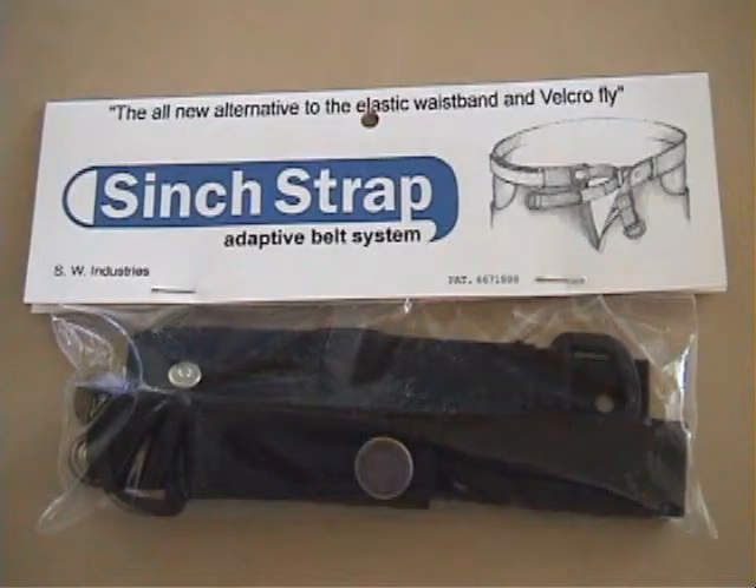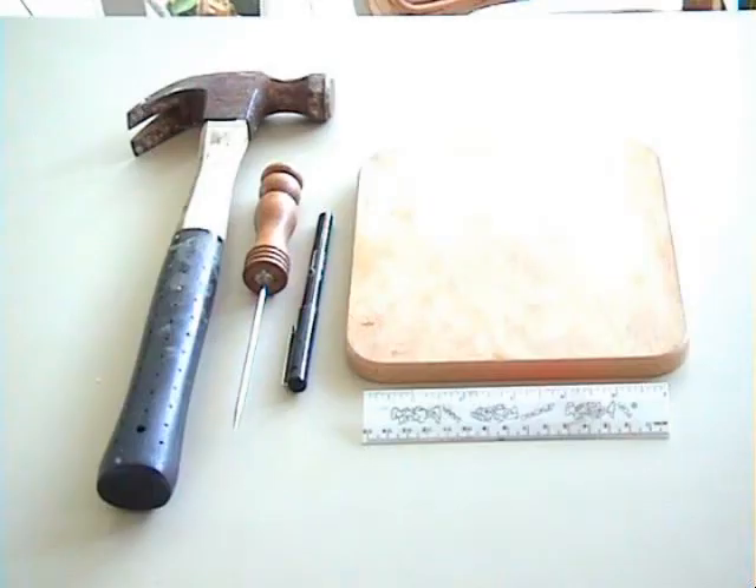The Cinchstrap belt system was designed and patented by an individual who has extreme hand limitations. It is designed for easy application and requires no sewing, though the initial application may require some help. Tools required for easy attachment can be readily found around the house.